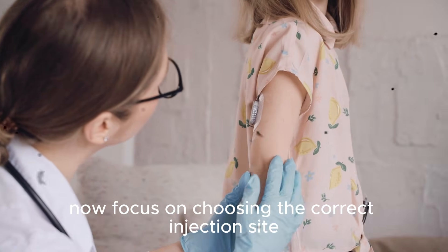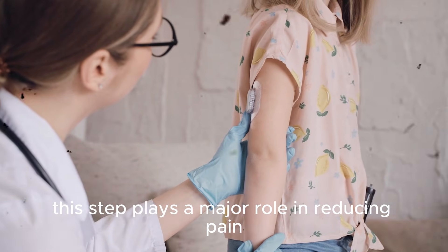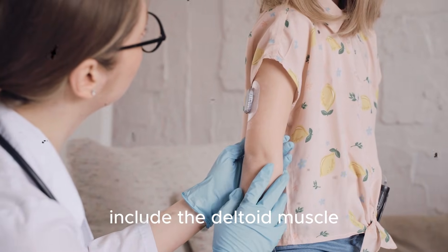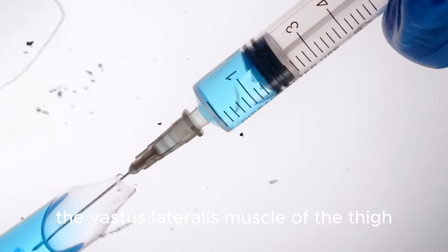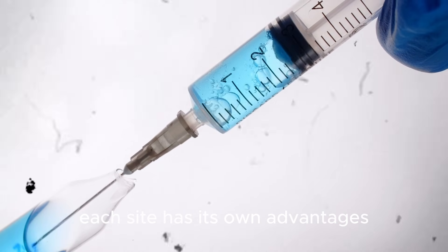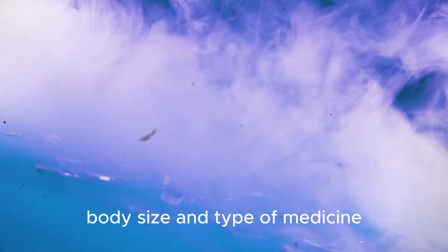Now focus on choosing the correct injection site. This step plays a major role in reducing pain and preventing injury. Common intramuscular injection sites include the deltoid muscle of the upper arm, the vastus lateralis muscle of the thigh, and the ventrogluteal muscle near the hip. Each site has its own advantages depending on the patient's age, body size, and type of medicine.